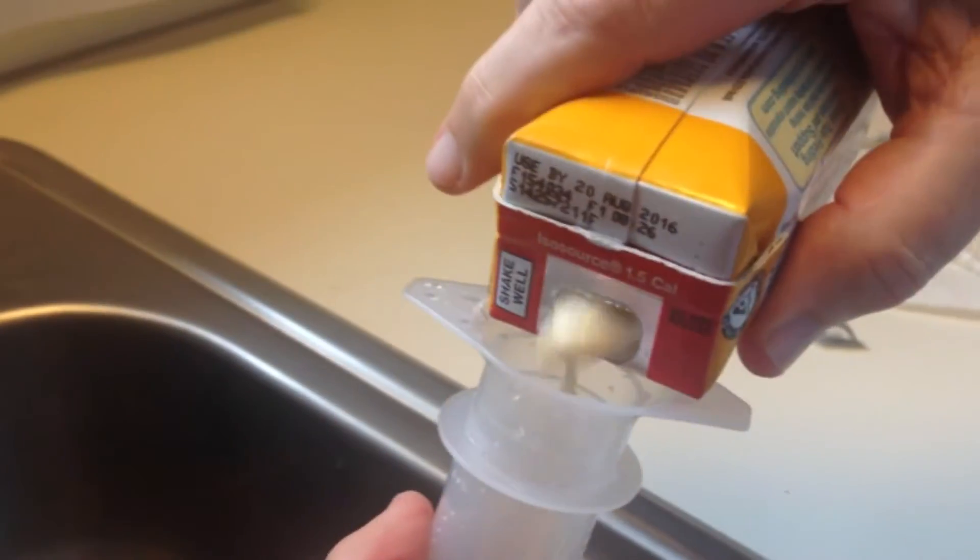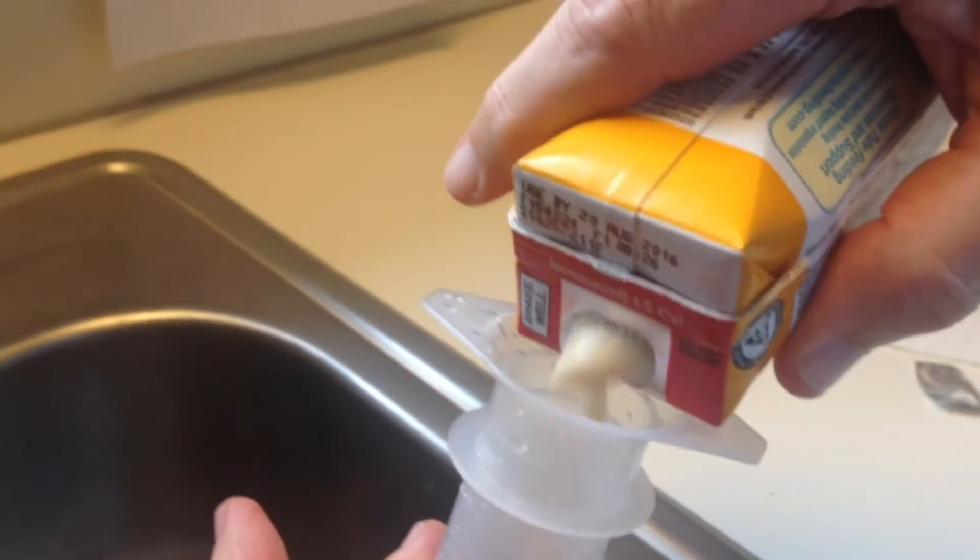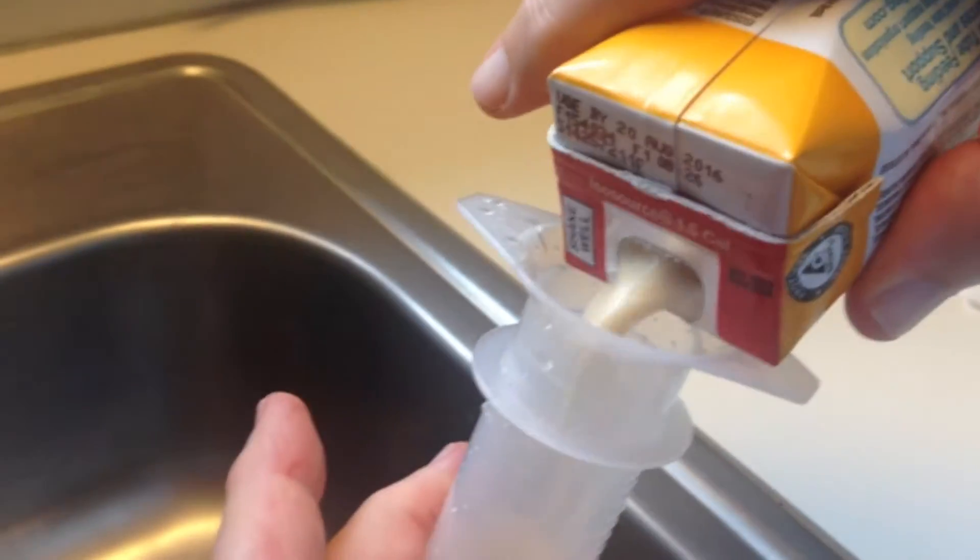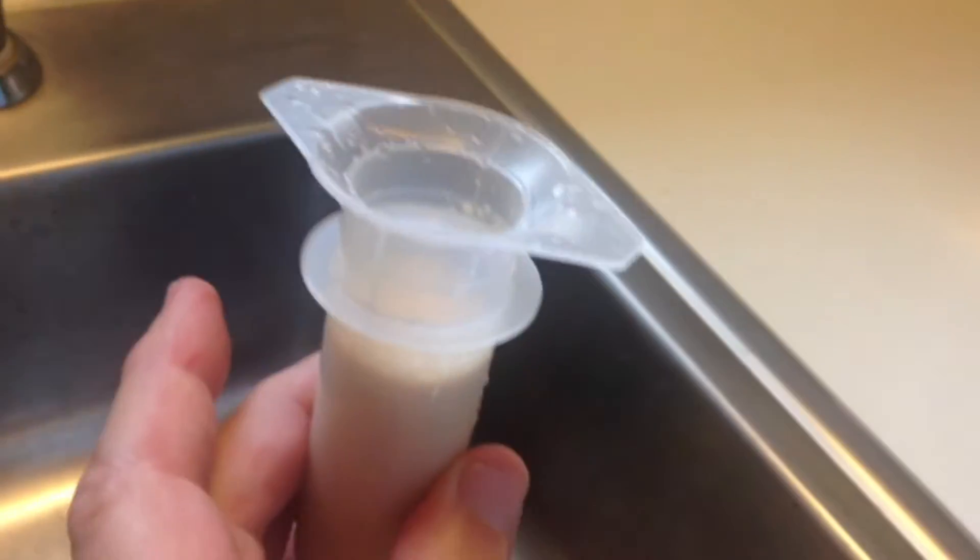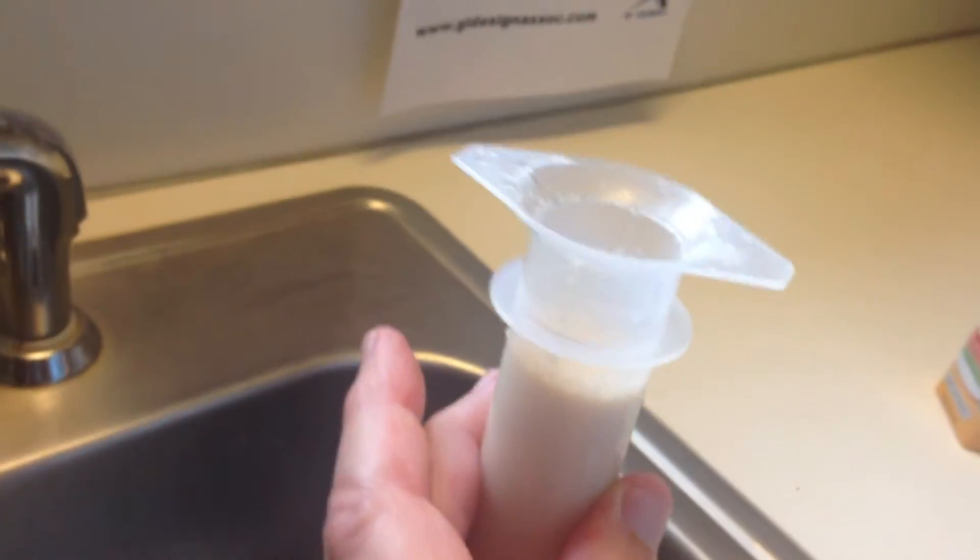We will fill up the syringe with 20 cc's of formula. We will now open up the hemostat and time it.